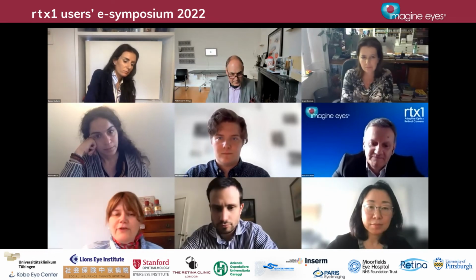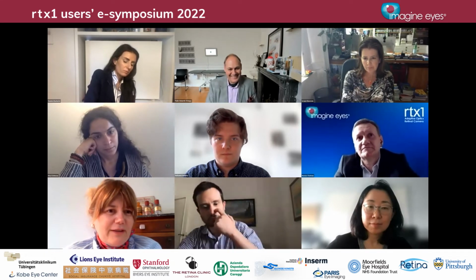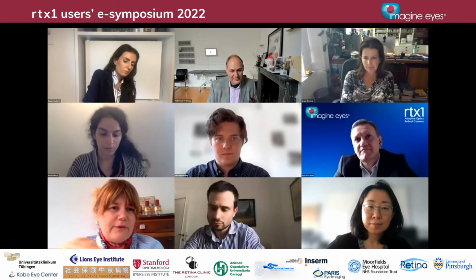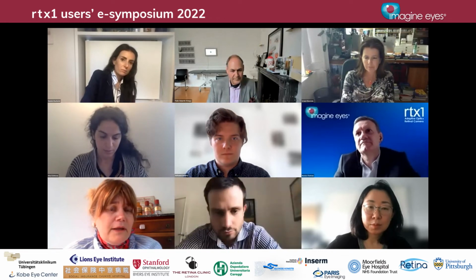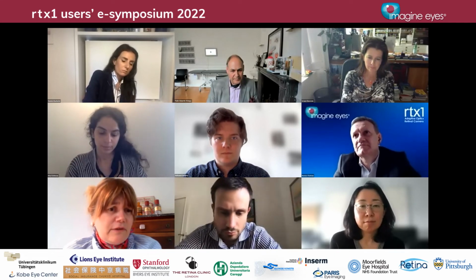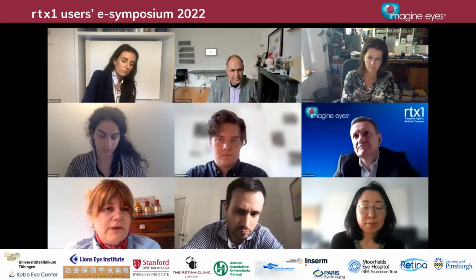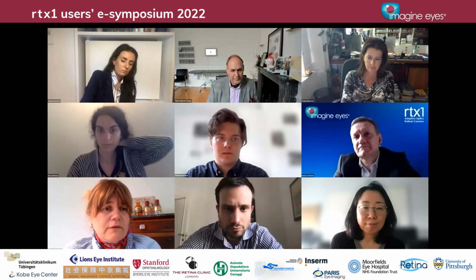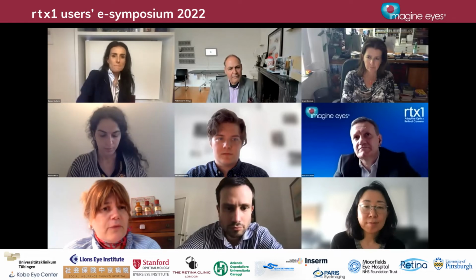So thank you. I'm a vitreoretinal surgeon as well. So when I was doing the picture, I was thinking as well surgery, and that's why we look at the photoreceptors layer with adaptive optics to see if the epiretinal membrane or a thick ILM in uveitic patients might correspond to a loss of photoreceptors. And it does, but is it a loss or is it an alteration that we see on the picture? So I think it will be interesting to do the peeling in those patients and have a look secondarily if we get a better view of the cone mosaic after peeling.